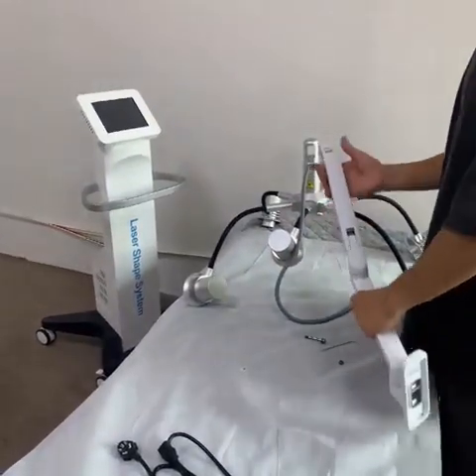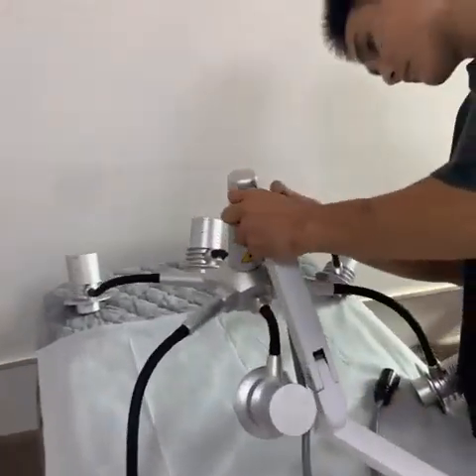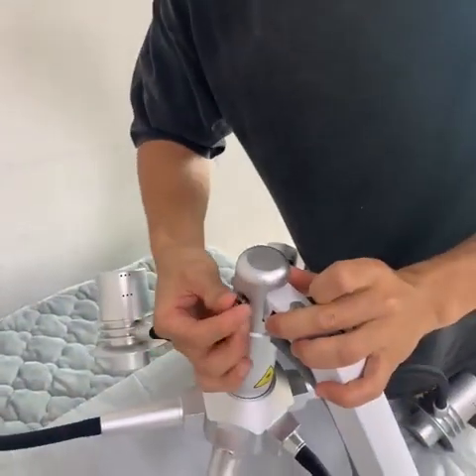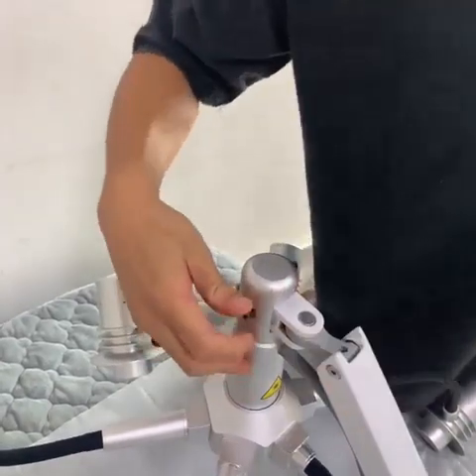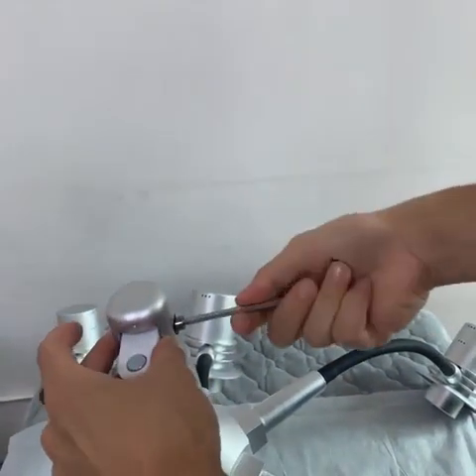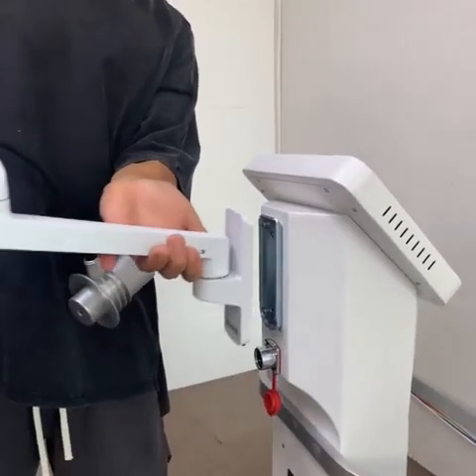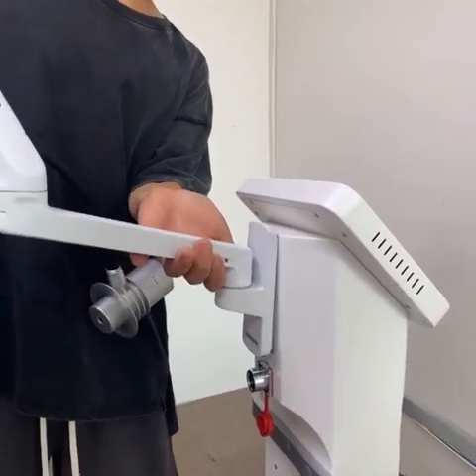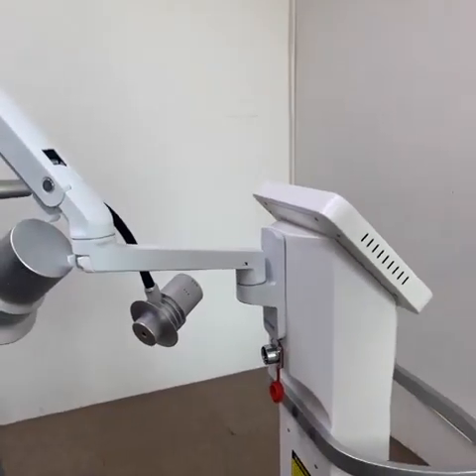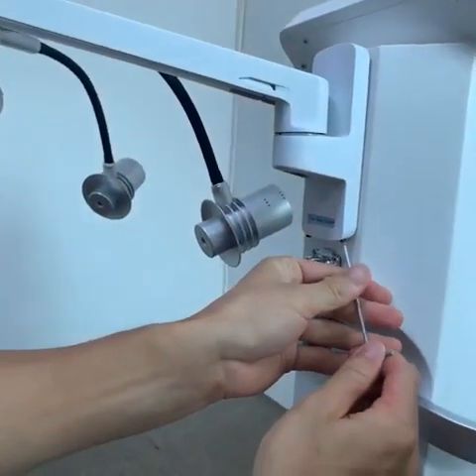Now we will install the laser shape system. First step, we should install the shell to the laser light and use the screw and the tools to tie it. Next, we should install this part to the machine from the top to the bottom and use the tool to tie two screws in the bottom. Tie it.